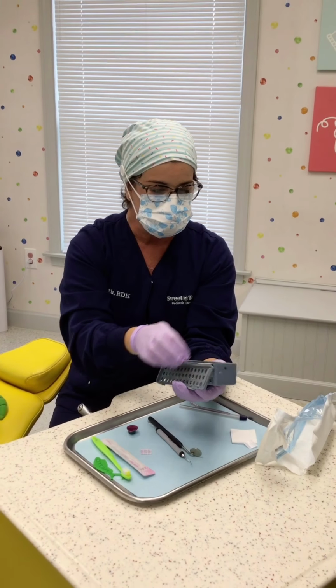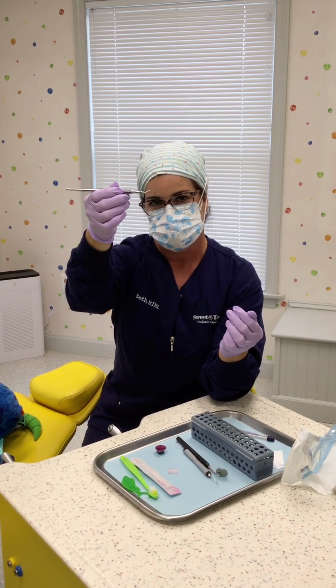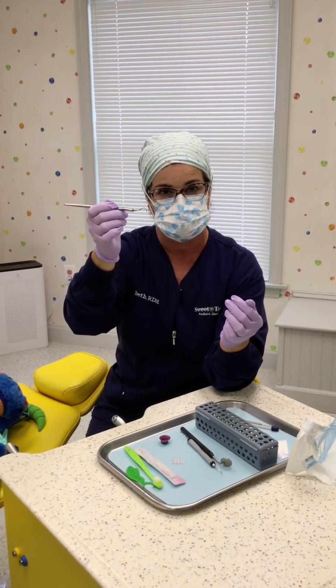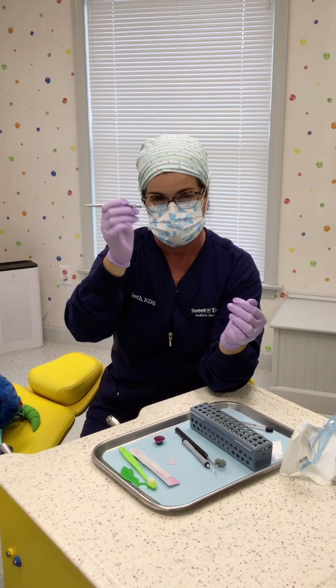I do have one other tool that I sometimes use. This one kind of is more of like a tooth cleaner. It helps kind of more sliding by the sides of the teeth to help remove any sugar bug germs, make sure things are nice and smooth. But it looks a little bit like the tooth counter, the Explorer one that I had, just a little bit bigger.